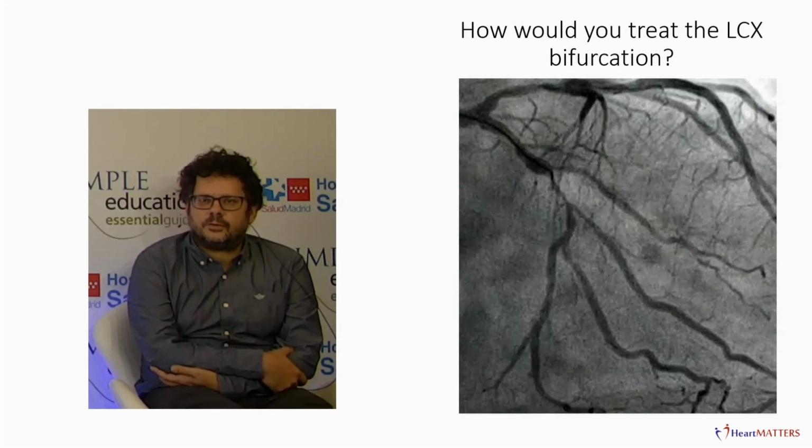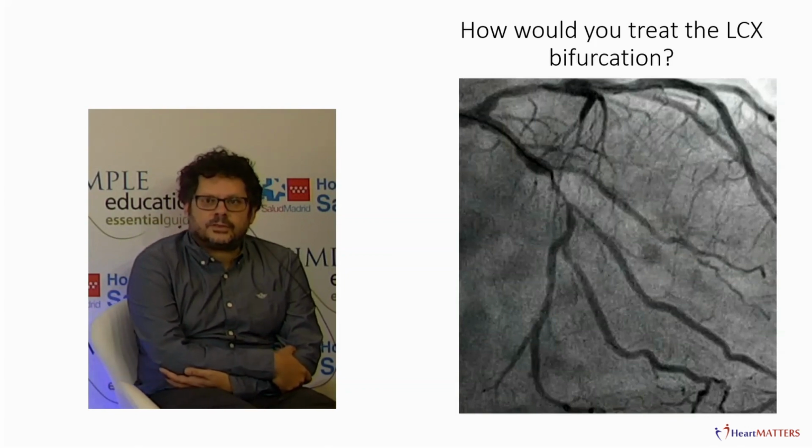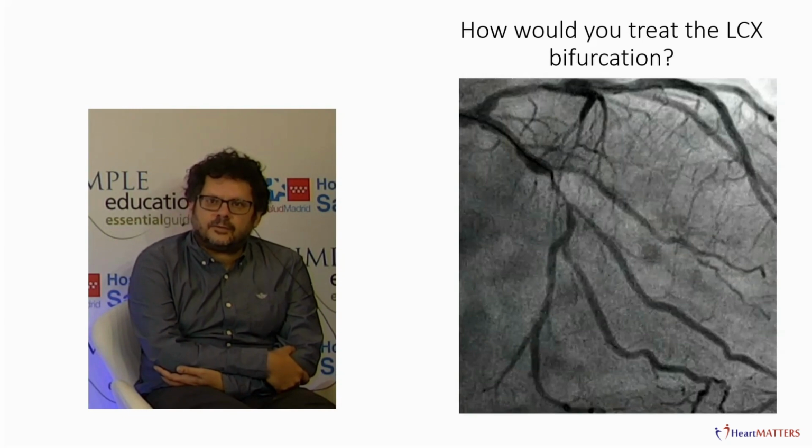Yeah, and I would add probably that, based on the results of the complete trial and also regarding the severity of stenosis, theoretically we know that in these patients, performing complete revascularization might improve outcomes. So in a way we are compelled to try to do a proper revascularization, but at the same time keeping the safety of the procedure.